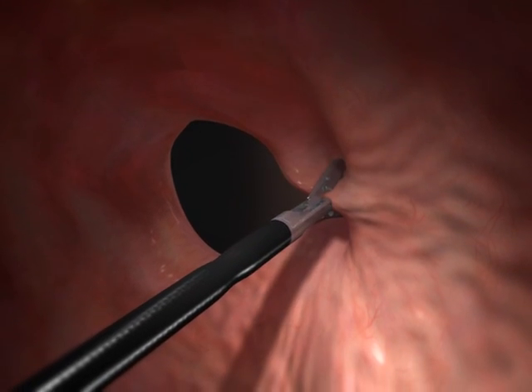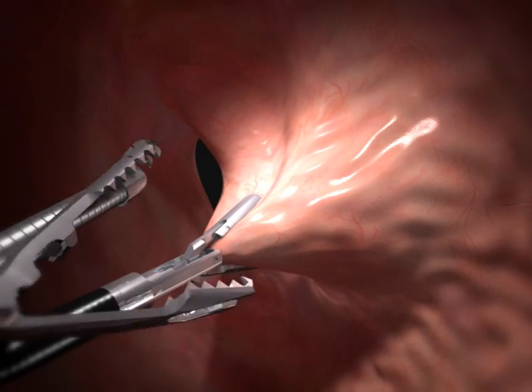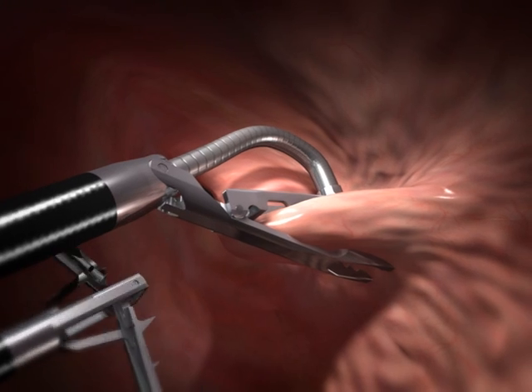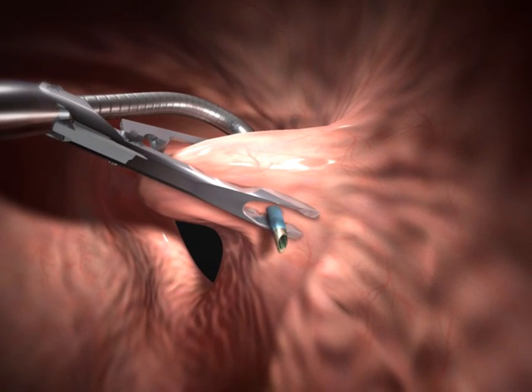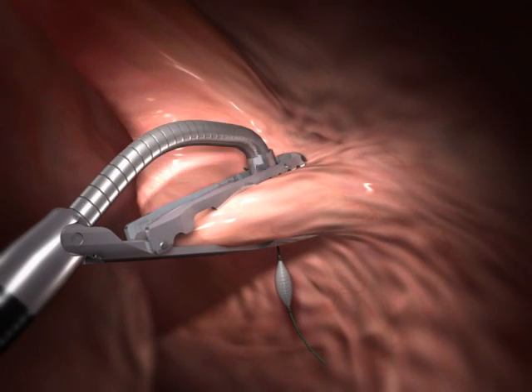The small grasper pulls a large bite into the jaws of the tissue plicator, creating a large fold in the tissue. The surgeon can vary the depth of the bite to ensure the desired result. Under direct vision, a needle is then passed through the tissue, and a pair of expandable suture anchors is placed on either side to hold it in place.